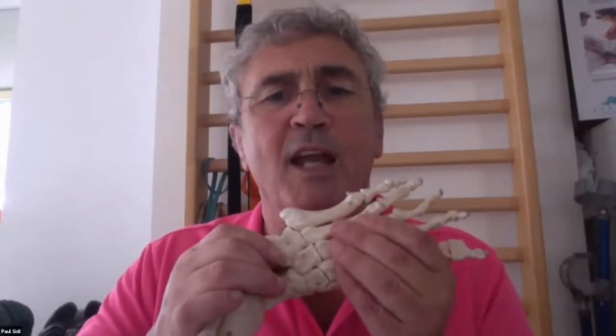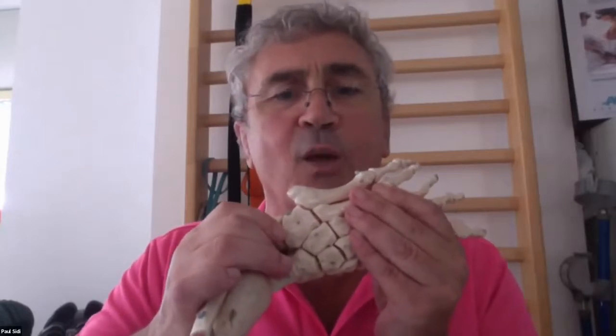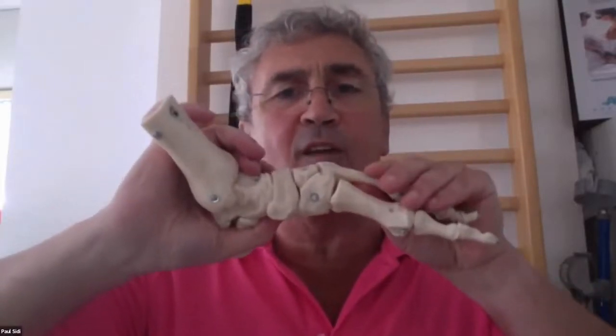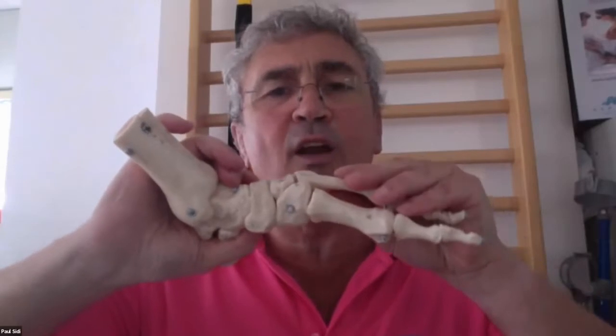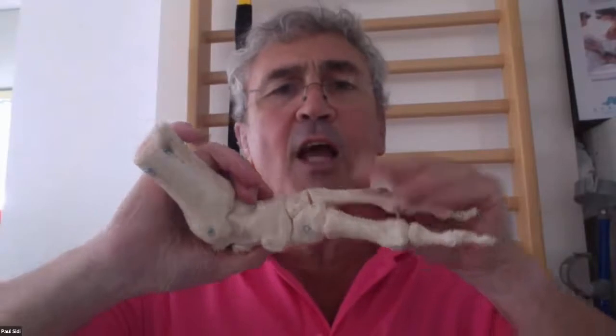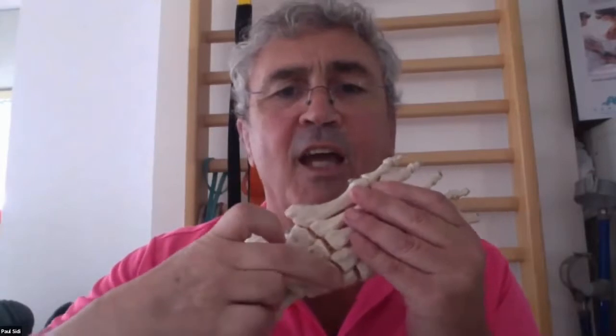But to move it in any way, if we do that, then we're actually getting in there. You probably see that's just opening up a little bit. All I'm doing there is just trying to bring the foot down a bit. So if you get them to try and dorsiflex actively while we're doing this, then we will actually be opening this up a bit, and then we can get the light in these areas.